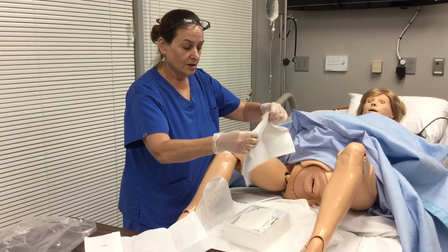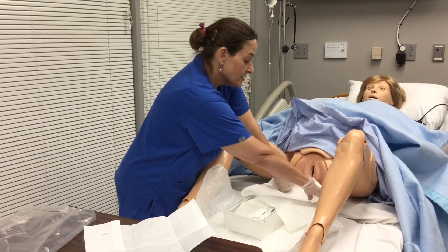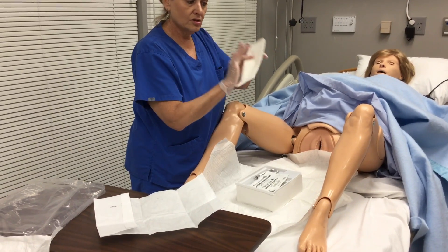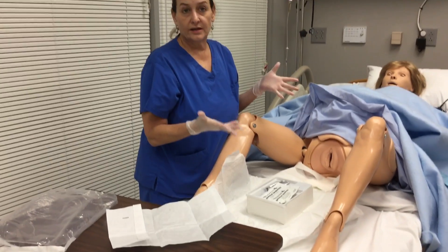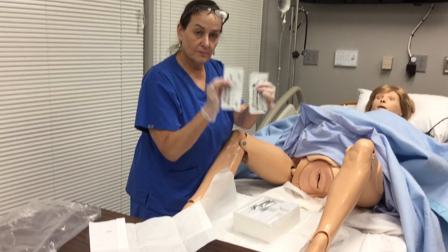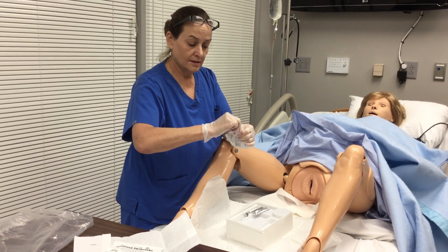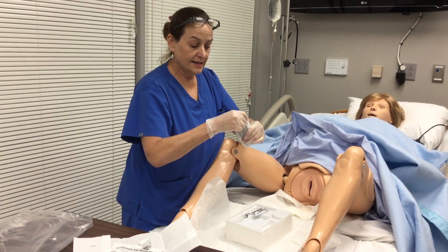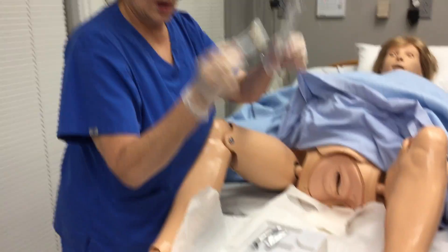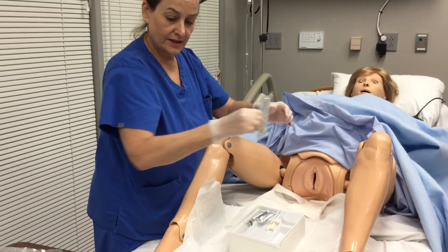You're going to take your drape. Remember, it's not like a typical patient where you tell them to pick up their bottom, because they can't. So without touching her, you're going to slide that drape right there. I take this extra drape and just put it right down under the vagina — it will catch the extra betadine. Your swabs — you will find this kit has two packets, but most kits have just one. Open them and prop them so they're easy to reach. If you leave them in the packet, you're going to end up shaking it off and that's going to get in your way.